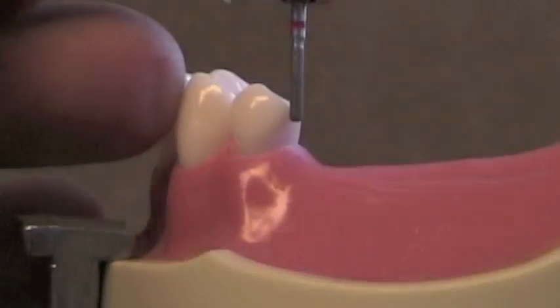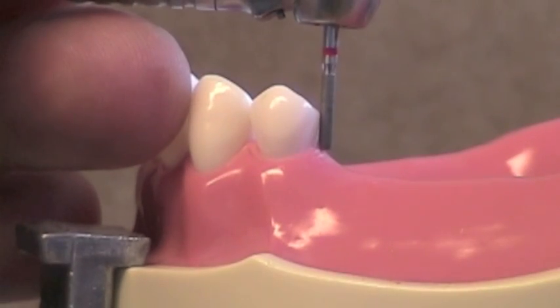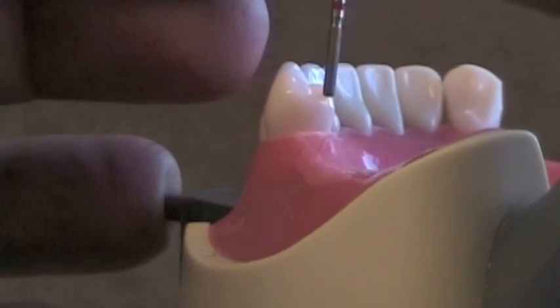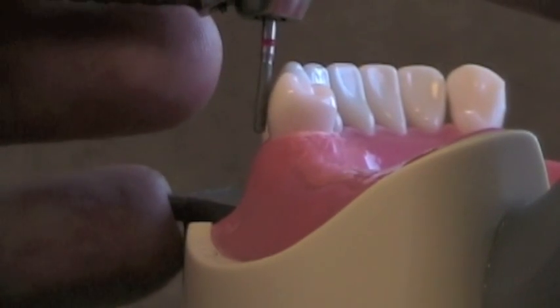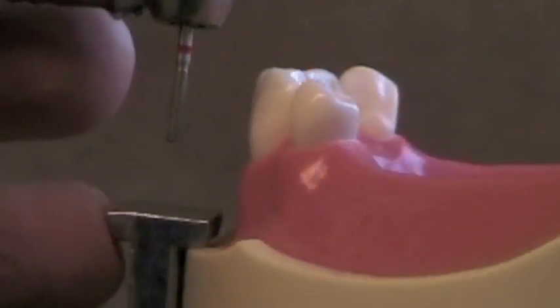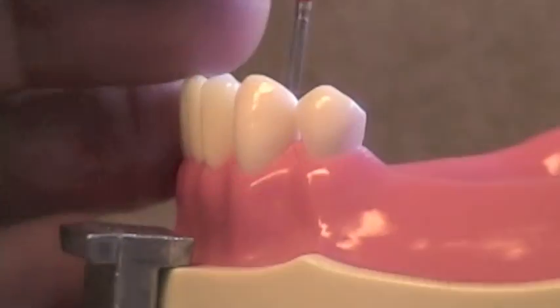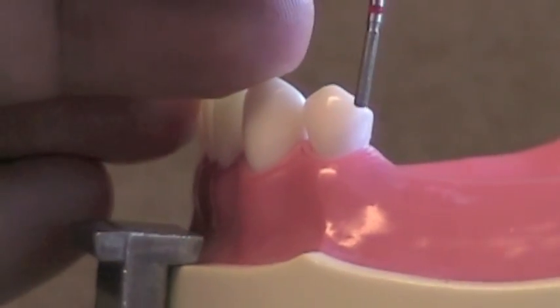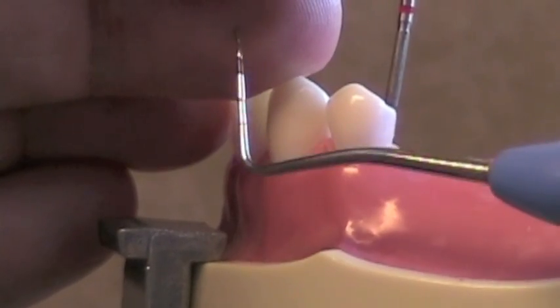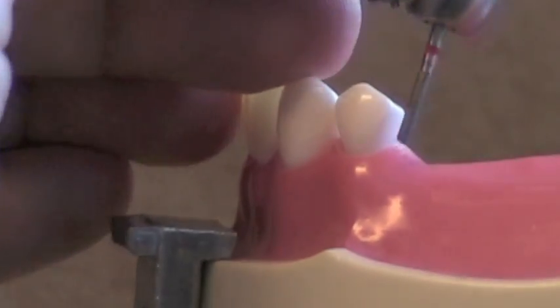Not only will I be looking at my tilt mesodistally, but at the same time I will also be looking at my tilt as I come around the corners buccalingually. That has to be the same as well. The other thing that's really important when doing preparations is having a very good strong finger rest. That's critical — otherwise you could be wobbling as you make your guiding planes.